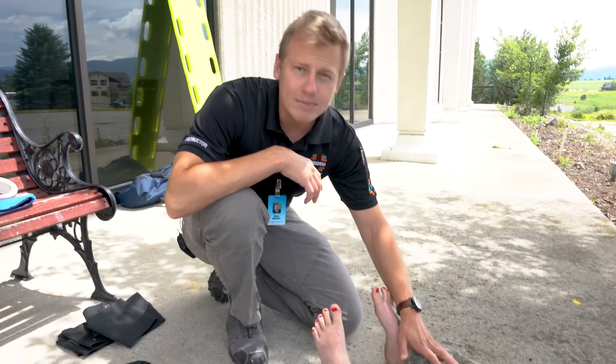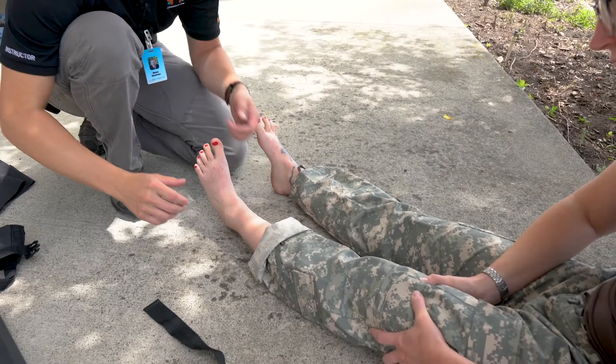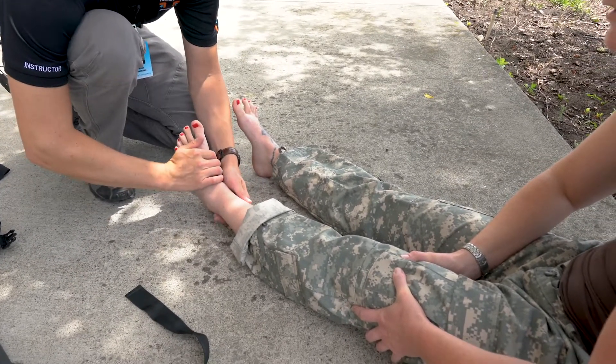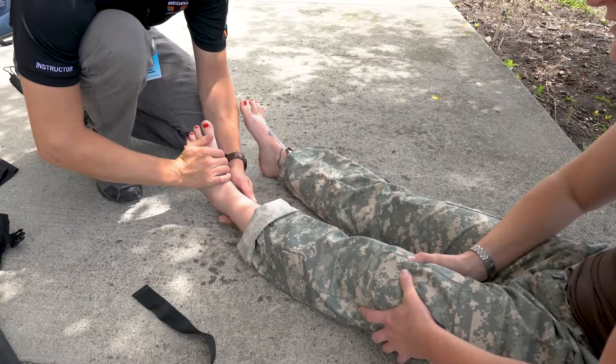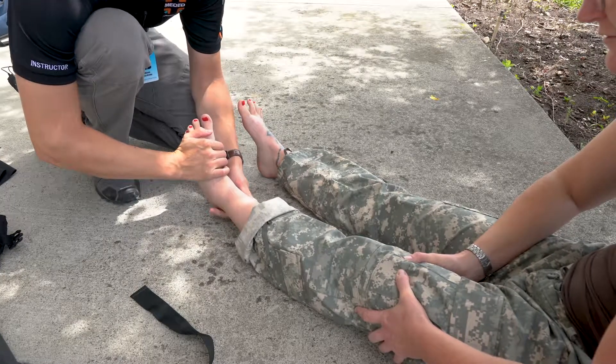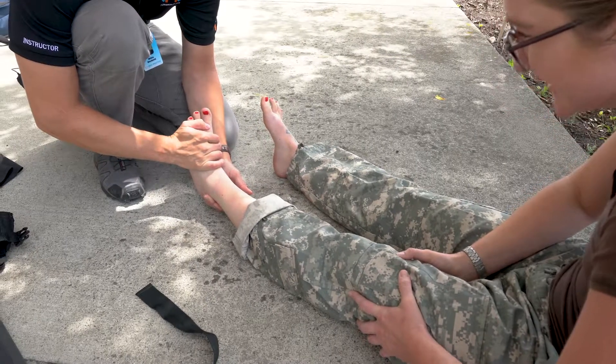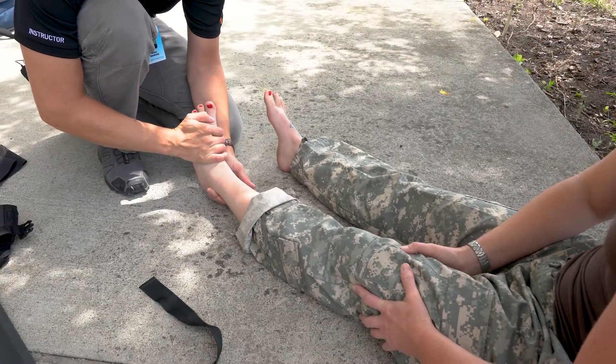When determining how much manual traction to apply, you can use the patient's opposite uninjured leg as a rough estimate point. I'm going to pull on your leg here — this is probably going to really, really hurt, but as soon as I finish, it's going to start feeling better, okay? Ready? One, two, three. Breathe nice and deep for me. There you go. Nice. Feels better.